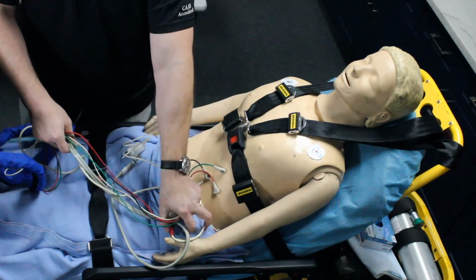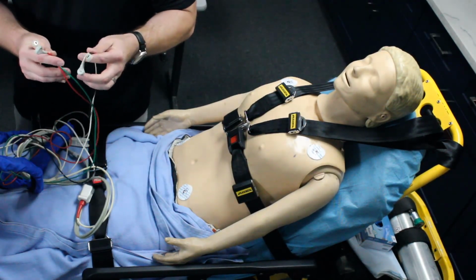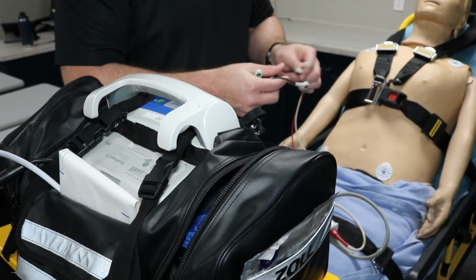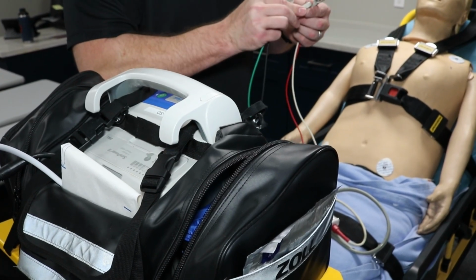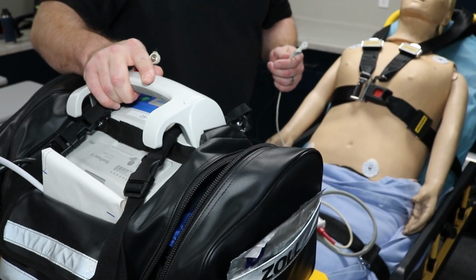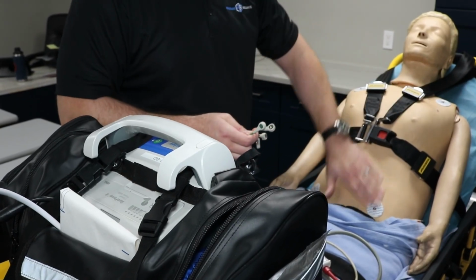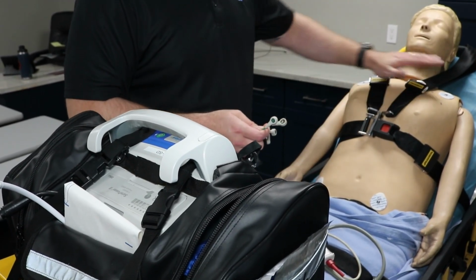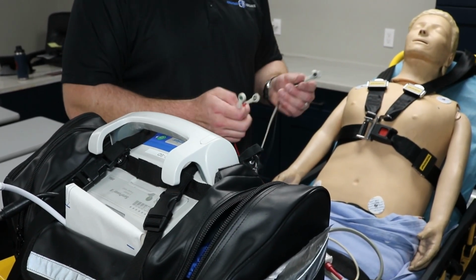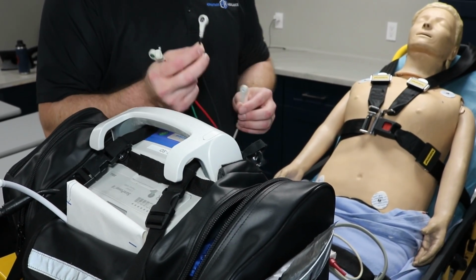And the first thing I want to do is hook up our leads. I know everyone's heard smoke over fire, white over right. So what we're going to do right now is go over our lead placement here. The X Series Zoll utilizes a 4-lead EKG. You can see we have our 4 electrodes already on the patient here. The upper chest, which can also be placed on the upper extremities, are our upper limb leads, which will be labeled RA and LA for right arm and left arm.